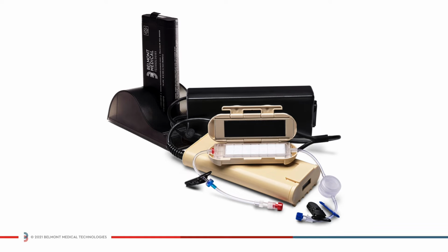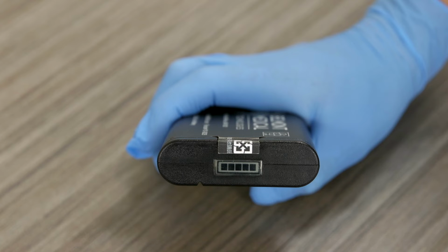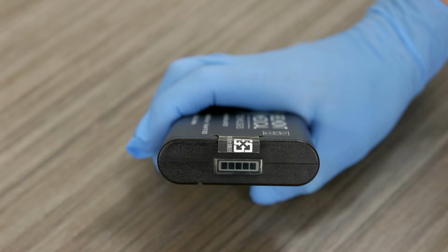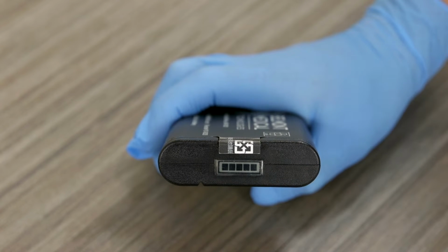The Belmont Buddy Lite system consists of the heater unit with battery compartment, a battery pack, and battery charger. The Belmont Buddy Lite AC additionally includes an AC power pack for continuous use. The Buddy Lite is powered by our interchangeable battery pack that requires minimal maintenance to ensure continued performance. A small 5-segment LCD panel located on the top of the battery displays the battery charge level. Each LCD segment represents 20% of the full charge capacity.